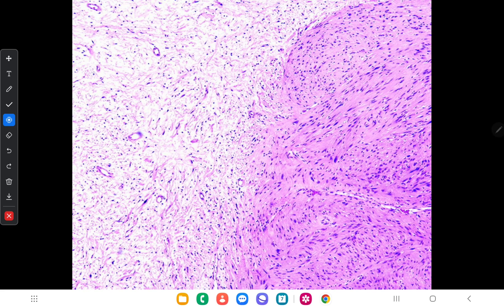Here is another picture showing the hypercellular area and the hypocellular area. In the hypocellular Antoni B area, you can see it is less cellular and the background is myxoid, meaning it contains mucopolysaccharides in the background.